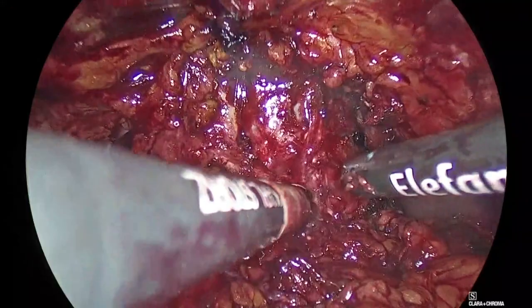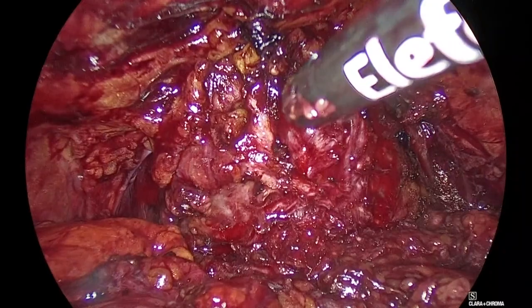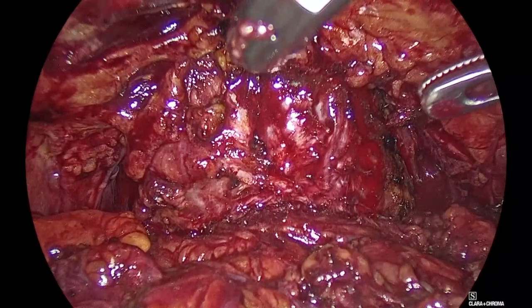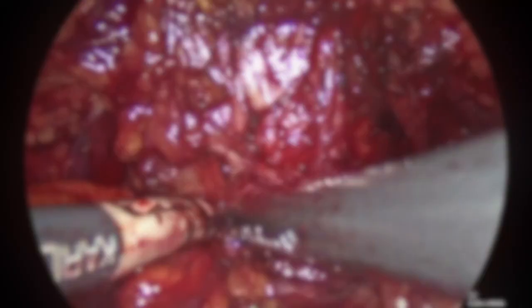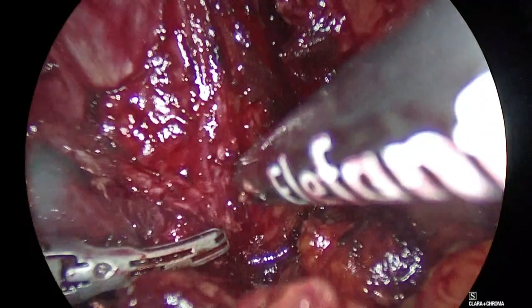Closer. So let me show you the balloon. I will inflate the balloon now just to show you what you were discussing before, also to make sure that this is coming the right way. Look at it. You see, so we are at the right level. You can see it? Yeah. Good. I deflate now again. Good. So theoretically, this should be the urethra. Padeli, rotate to the right. To the right, Padeli.